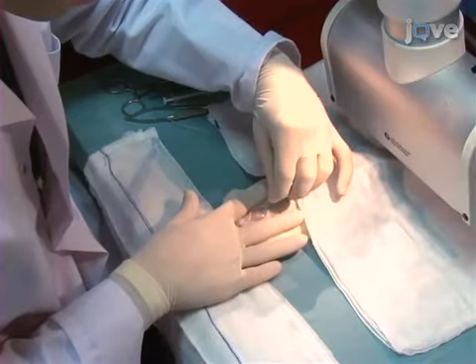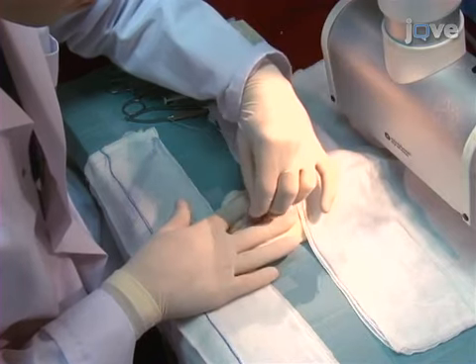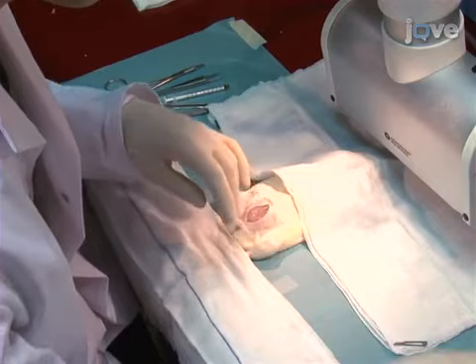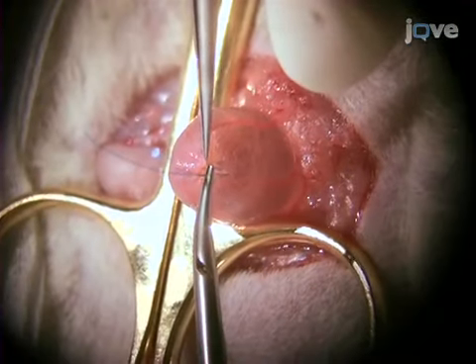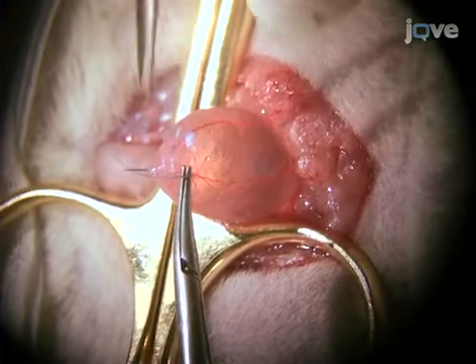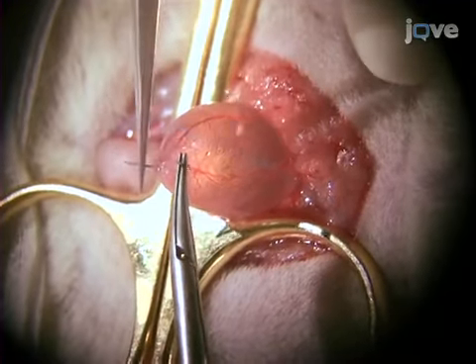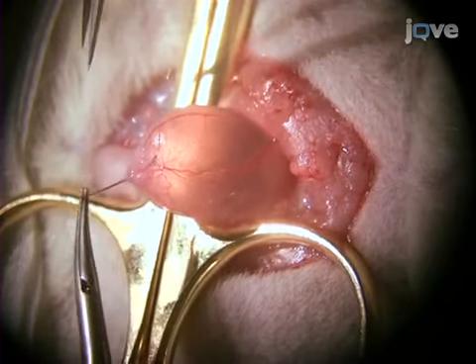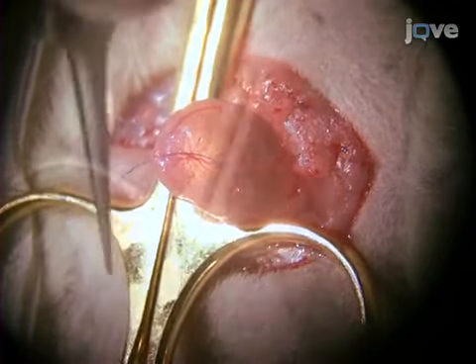The following surgery is performed on both rats and mice in the same manner. Begin by performing a lower midline laparotomy to expose the bladder. Next begins the most critical portion of the surgery. Under a surgical microscope, place a purse string suture in the bladder dome using non-absorbable monofilament 6-0 suture.